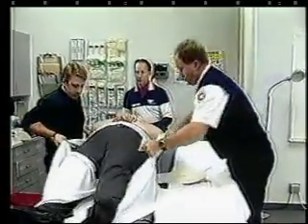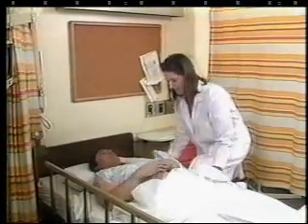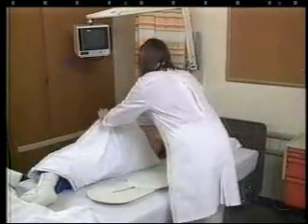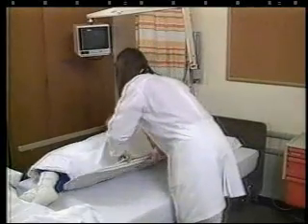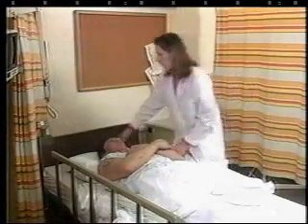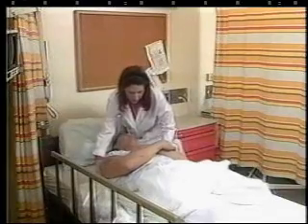Incidentally, the same technique can help with some patients' ongoing need to be repositioned or boosted up in the bed. Using the seat placement techniques shown for the patient in a supine position, lay the Beasytrans vertically under the patient. Make sure the seat is in the middle of the system. Then gently glide the patient higher in bed.